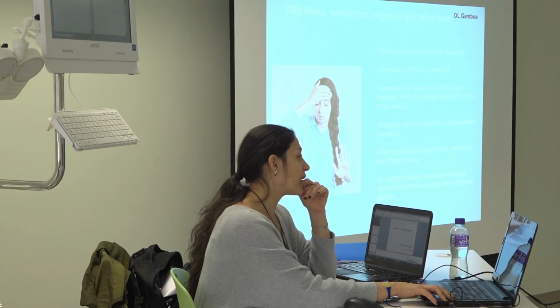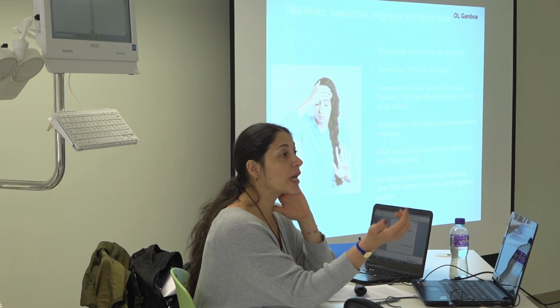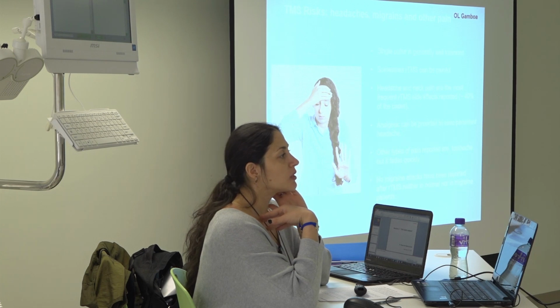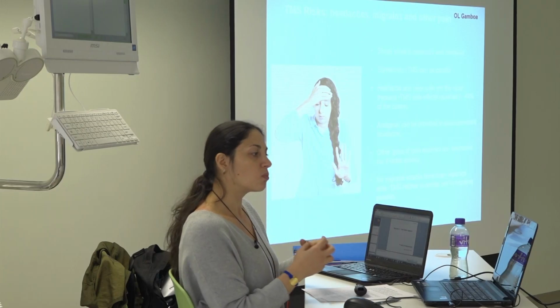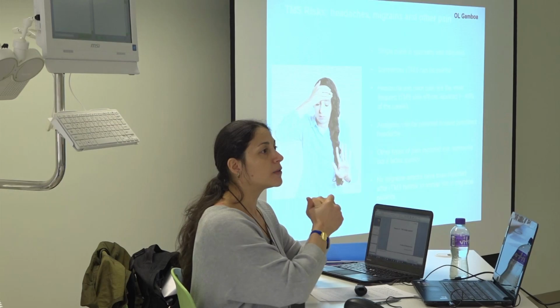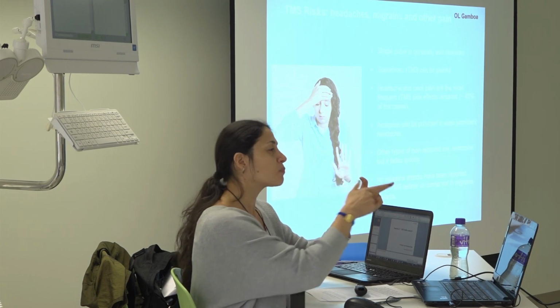According to the reports, headaches and neck pain are the most frequent rTMS effects reported, in around 40% of the cases. It's not my experience. I have been working on this for 10 years, and headache is not the highest reported in my experience. But there are other labs which have actually reported it, and you can see that in the papers too.